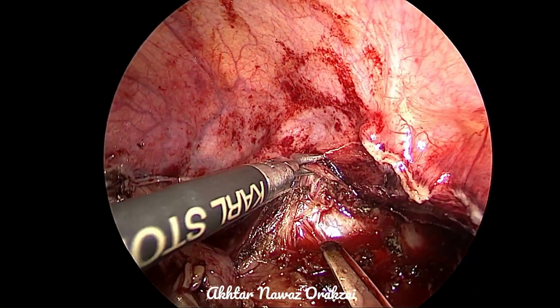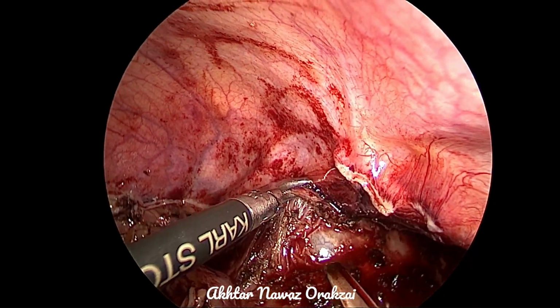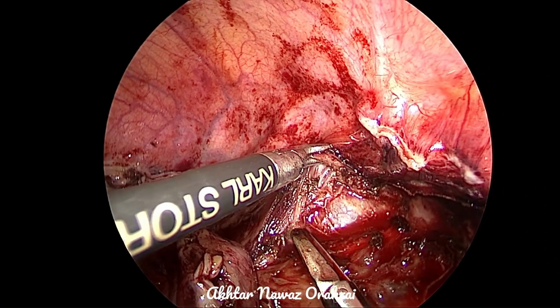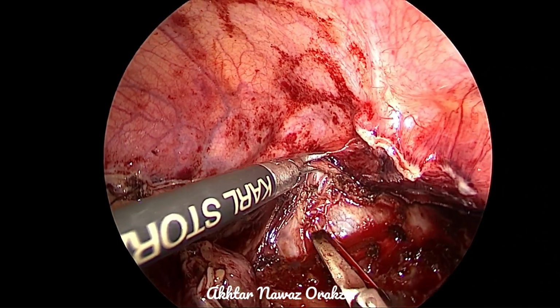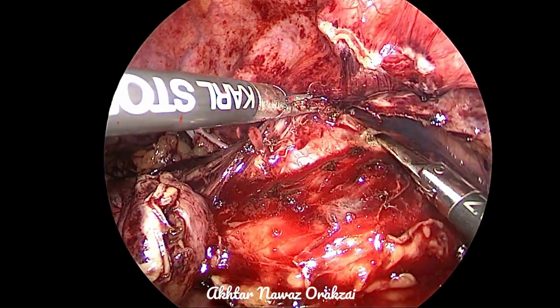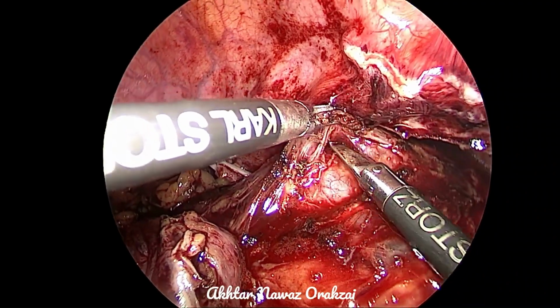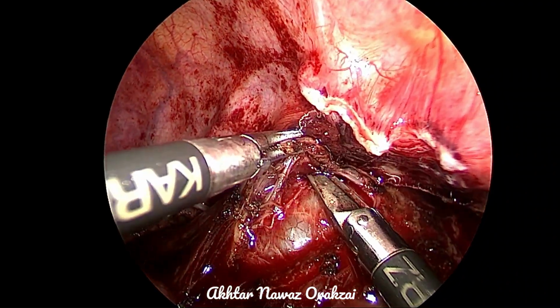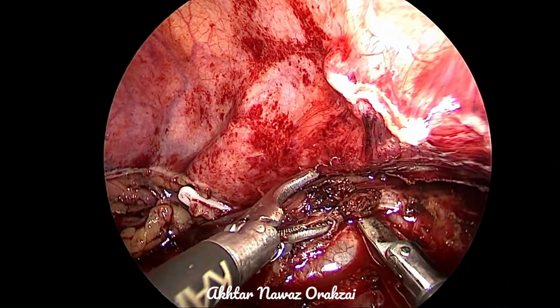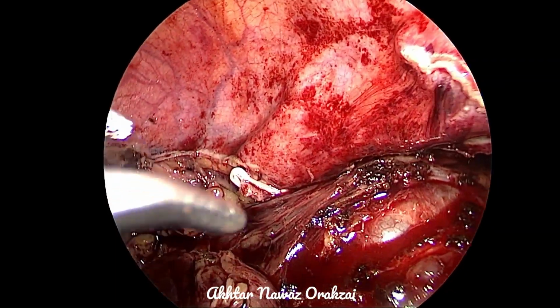Small vessels being taken care of. So the scissor is being used with monopolar diathermy for separating the mucosa from the detrusor wall in order to promote the formation of a submucosal tunnel.